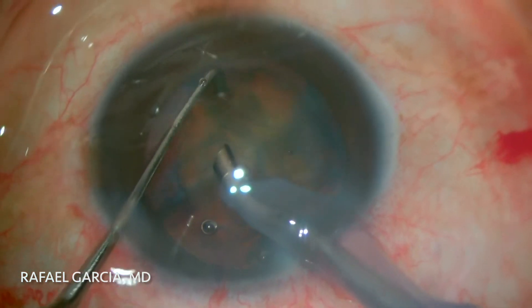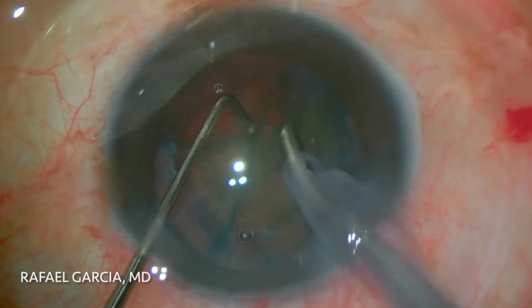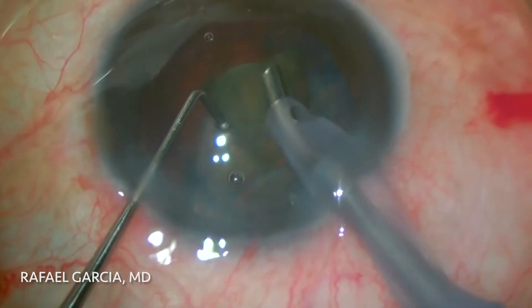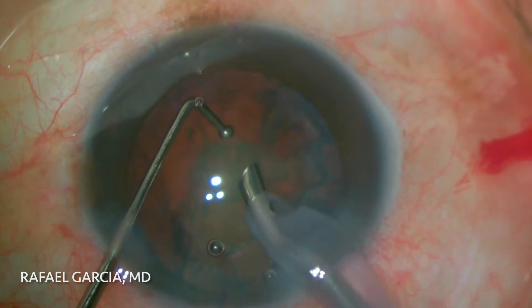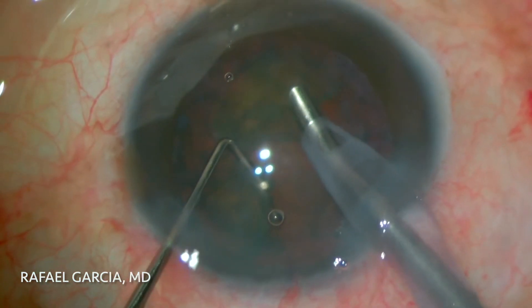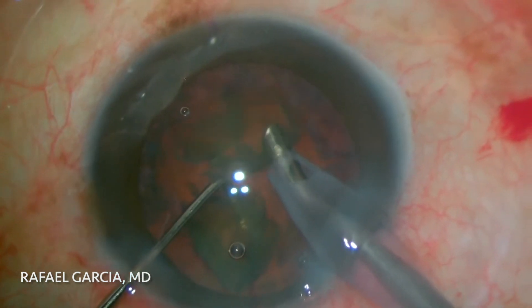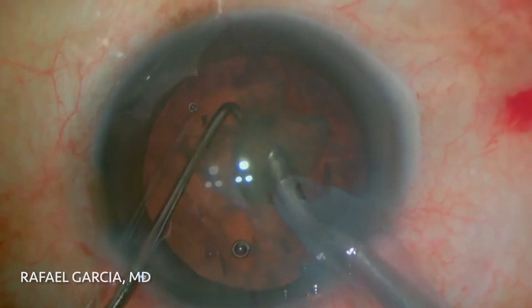For conquering the cataract pieces, we like to mostly use the torsional ultrasonic setting. This way, less ultrasonic energy is employed and we avoid corneal edema, giving the patient clear vision already in their first post-op days. When just a few pieces are left, the chopper is kept in a safe position to prevent the capsule from coming forward to the phaco tip as the vacuum builds up.